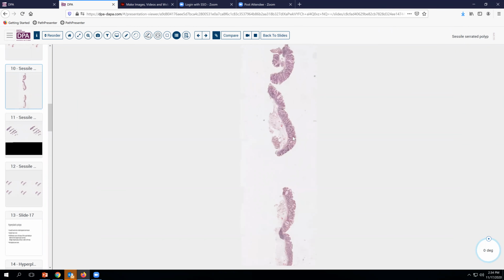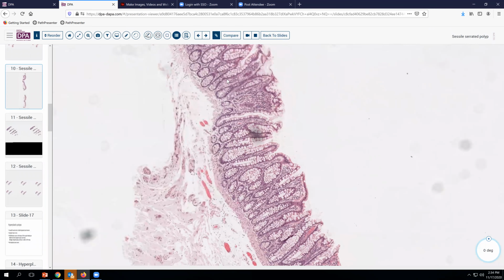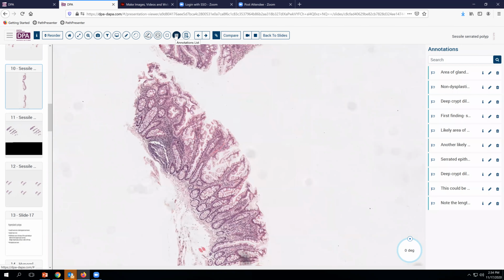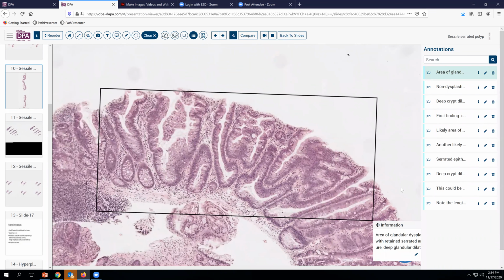So here, for example, within the presentation, a learner could view this, review the digital slide and go, there's the issue. Additionally, annotations were available. So for example, just right here, there's the annotation, the details that go along with it to help ensure and reinforce the learning that is intended from this kind of presentation. So in this manner, content could be presented in a systematic, organized fashion, allow comparison and contrasting and individual pacing to accomplish the educational goals.